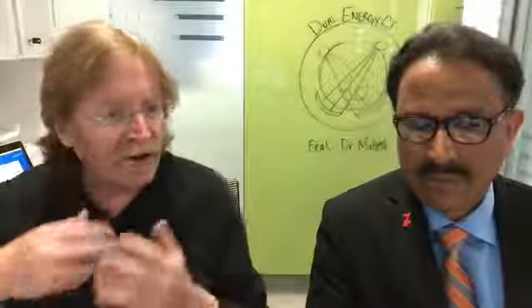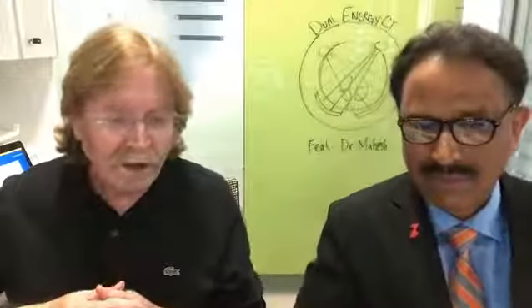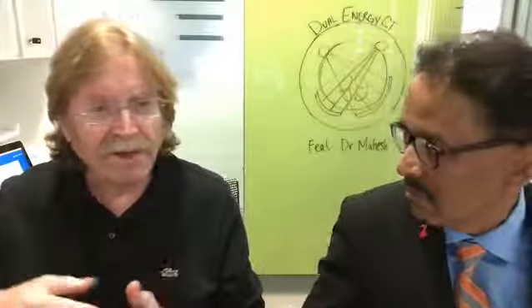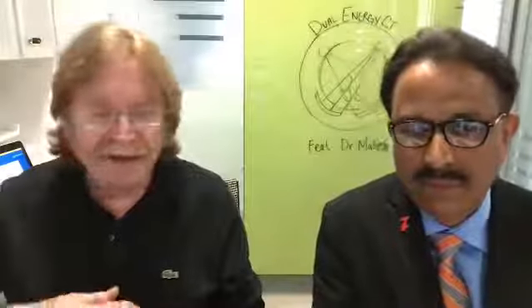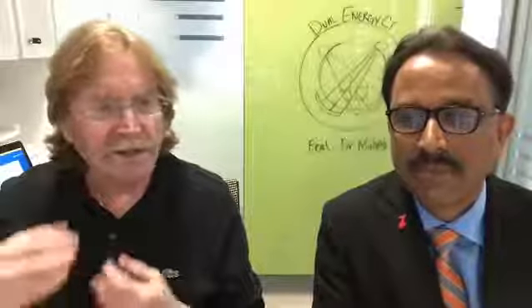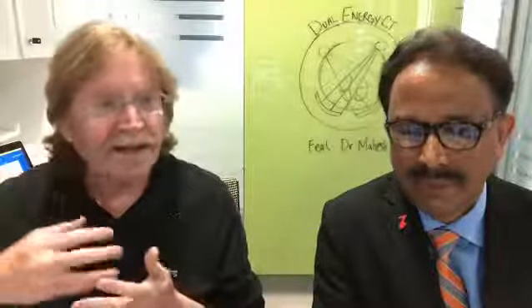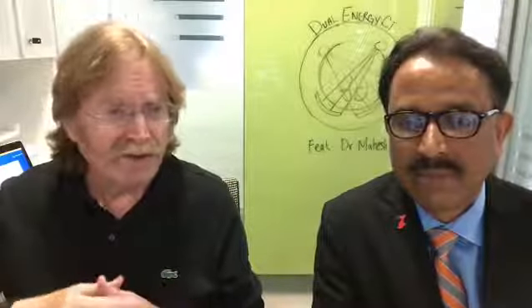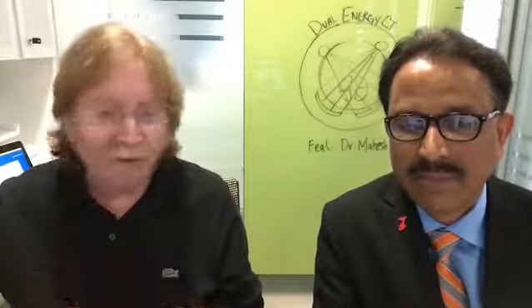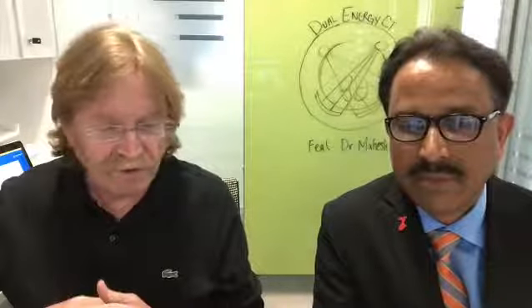I know for us in our practice, one of the easiest uses, and I always tell people the best use of dual energy, which nobody can argue about, is for bone removal. The K edge is different for iodine and calcium, and so things like the head and neck, no matter what good algorithm you have for doing bone removal, you can't do it as well as you can with dual energy. And for peripheral runoff studies, nothing's better than dual energy.